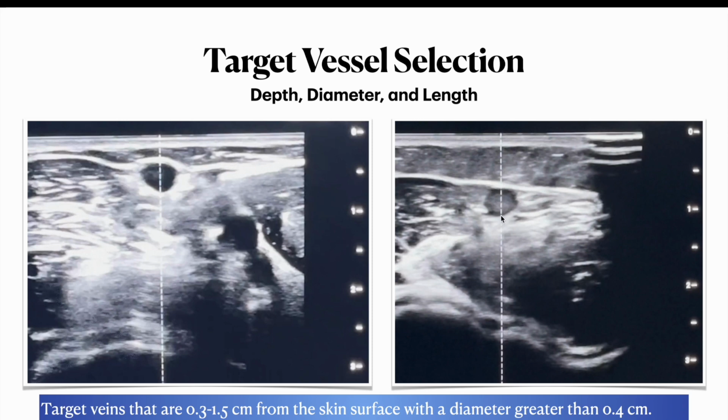Now, there are ways of measuring the diameter of a blood vessel, but to me this is a slightly time-cumbersome and unnecessary step. After just a few attempts with ultrasound-guided IVs, you will have a good sense for if the diameter of a vessel is wide enough to make it a good target.